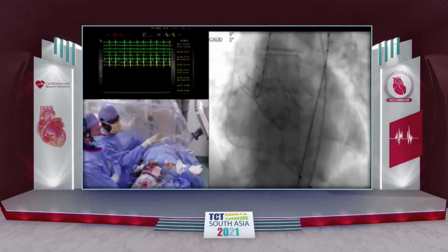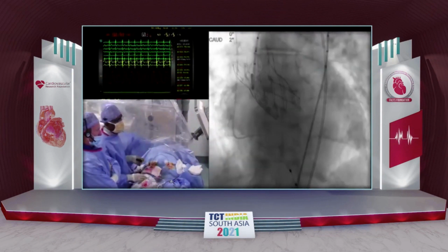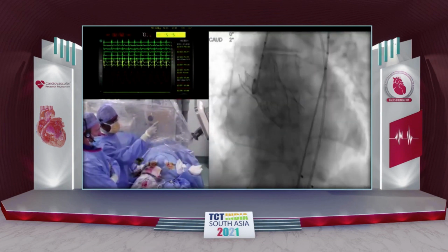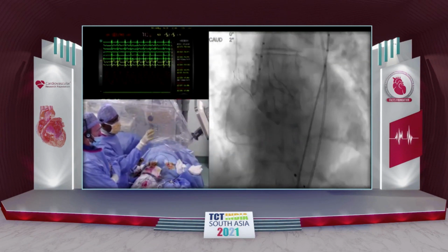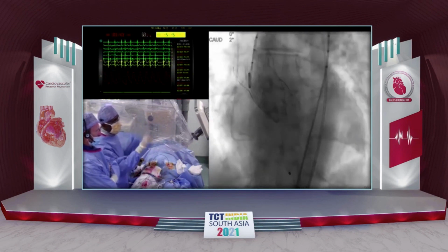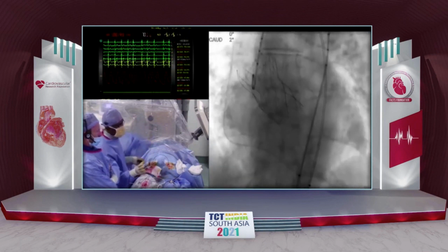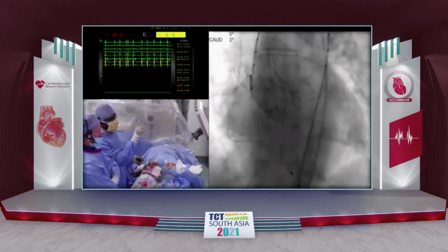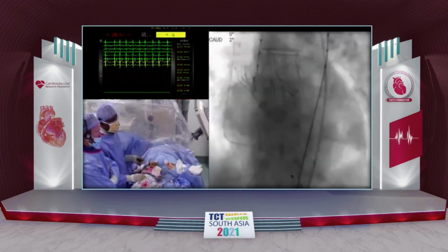In horizontal anatomy, this is what we get. It's equal distance on both sides. It's great. Now, there's horizontal anatomy, and then you also have how short or long your ascending aorta is. So in this patient, the ascending aorta is just long enough for the frame to fit in nicely. If you have a very short ascending aorta or an ascending aorta that starts bending very early, no matter what technique you have, no matter what valve you have, unless you use a Sapien valve, you will be lower on the left coronary and higher in the non-coronary, if that makes sense.